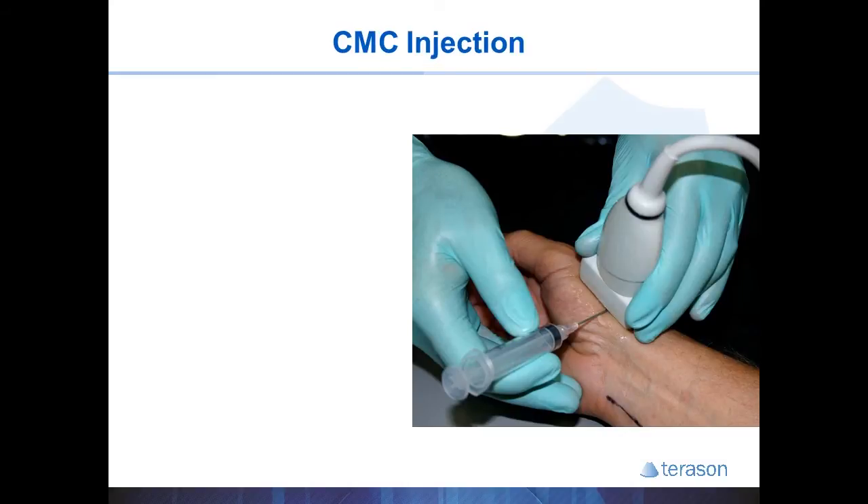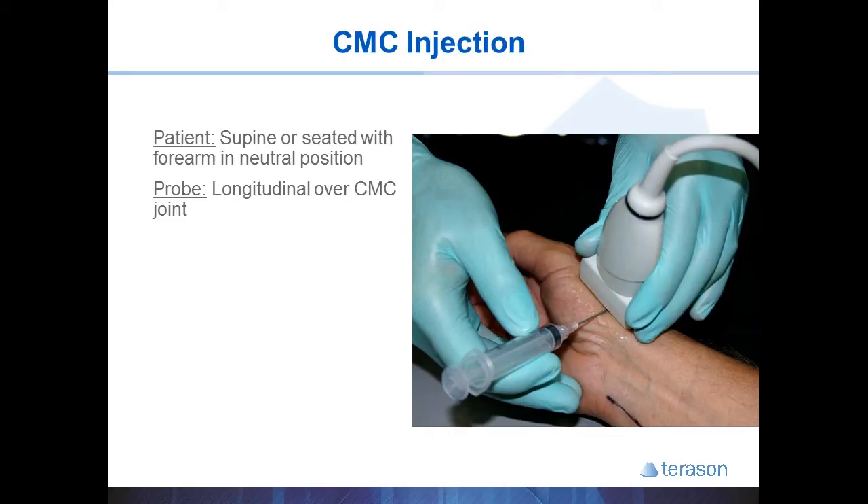The CMC joint of the thumb is a small and sometimes difficult joint to enter when there is a large amount of joint destruction and osteophytes present. You start by placing the patient's hand in a neutral position and place the probe so you see a long axis view of the first metacarpal bone. Then slowly slide the probe proximally until you see the CMC joint. The needle will use a short axis approach, typically coming from a palmar direction to avoid piercing the first dorsal compartment contents on the dorsal side of the probe.